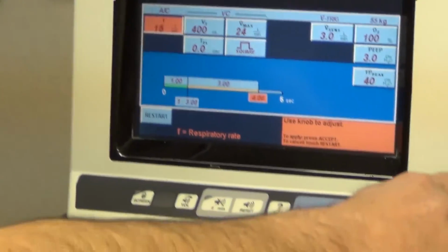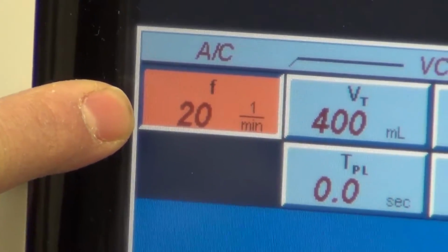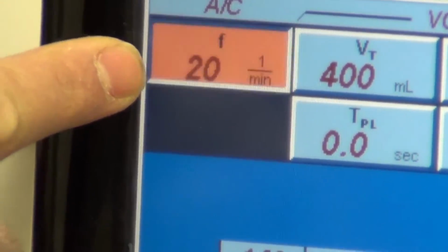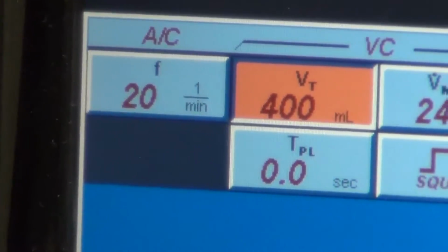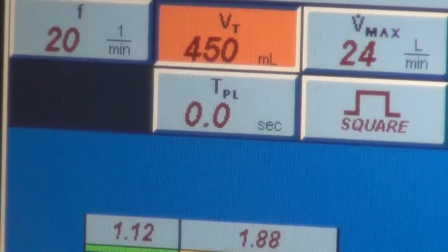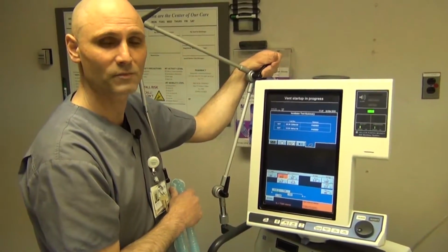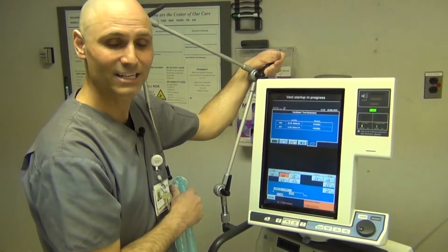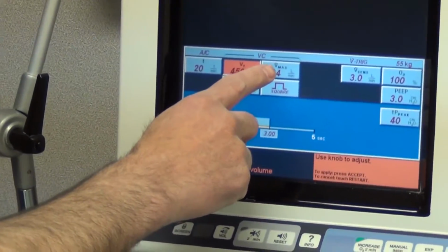First one, to make a change to your frequency, you highlight, spin this knob, and notice we set a frequency of 20. Normal respiratory rate to start with will be anywhere from 12 to 20. Whatever the physician decides, sometimes they go up to 24. Dr. Sadat a lot of times likes to go to a respiratory rate of 24. Next one, to make the change, is the same method. Let's say we're going to use a tidal volume of 450. The normal method of finding out what tidal volume to use with a patient will be anywhere from 6 to 8 mL per kilogram of ideal body weight. So we'll just choose 450 right now.